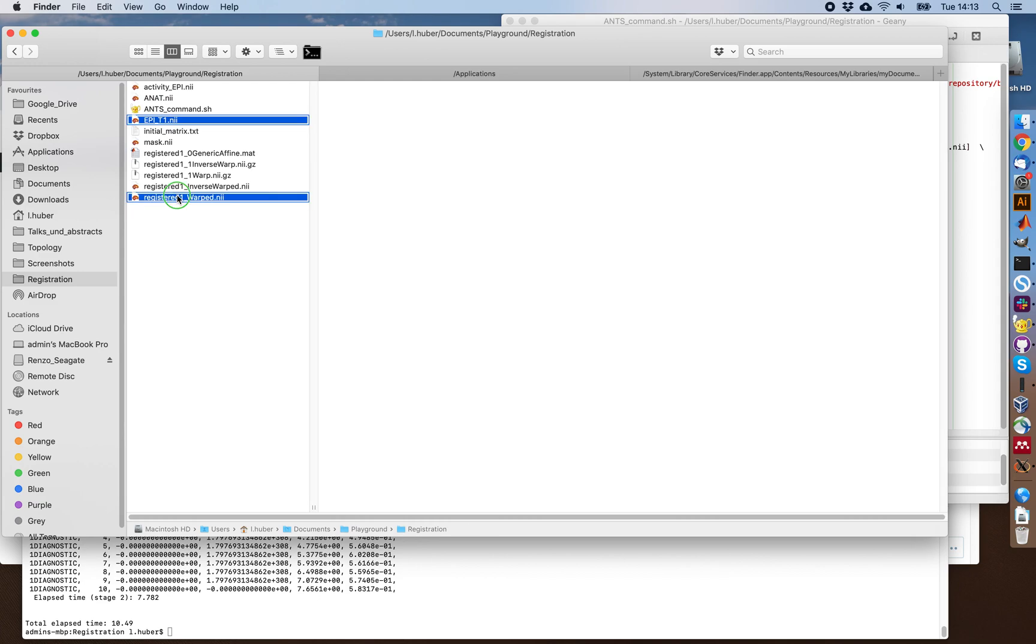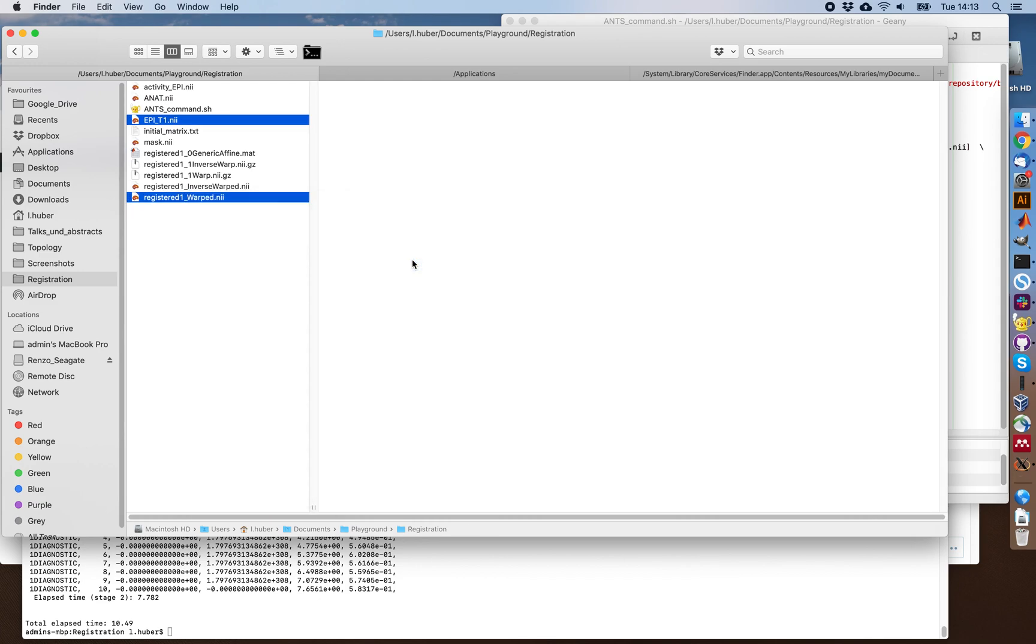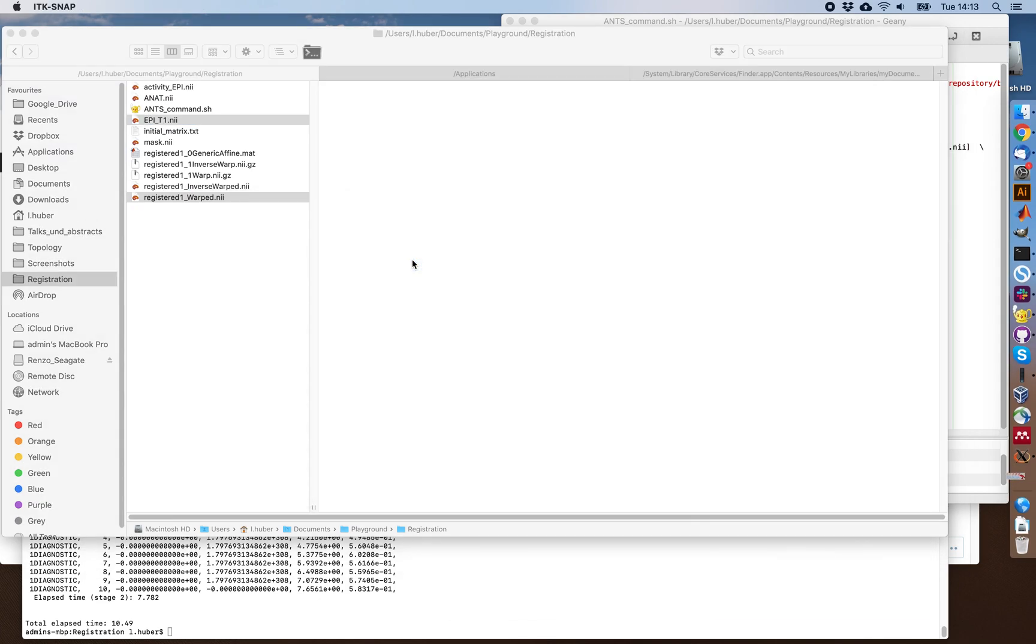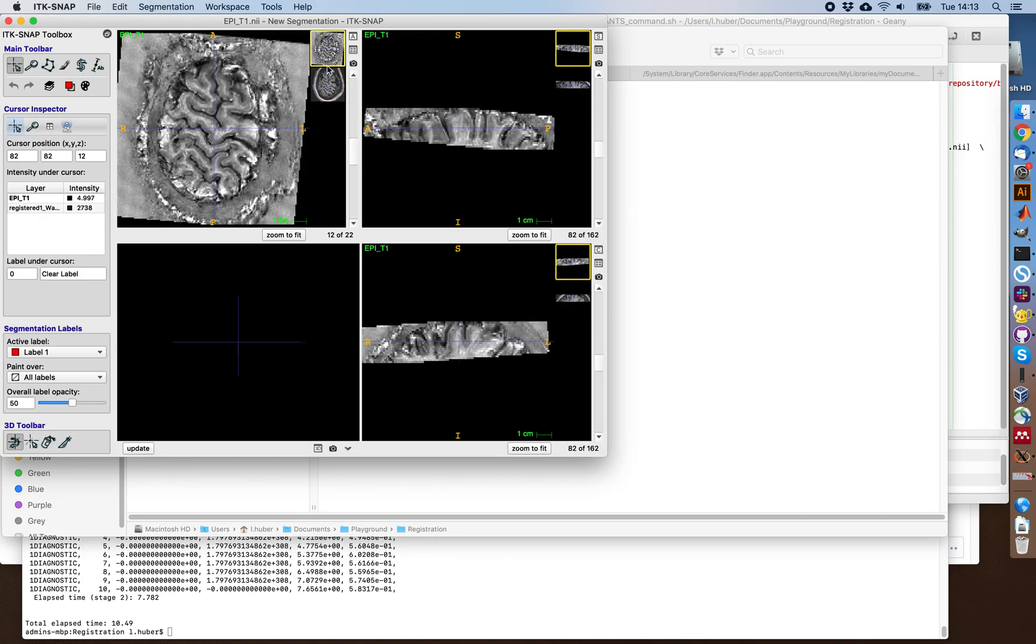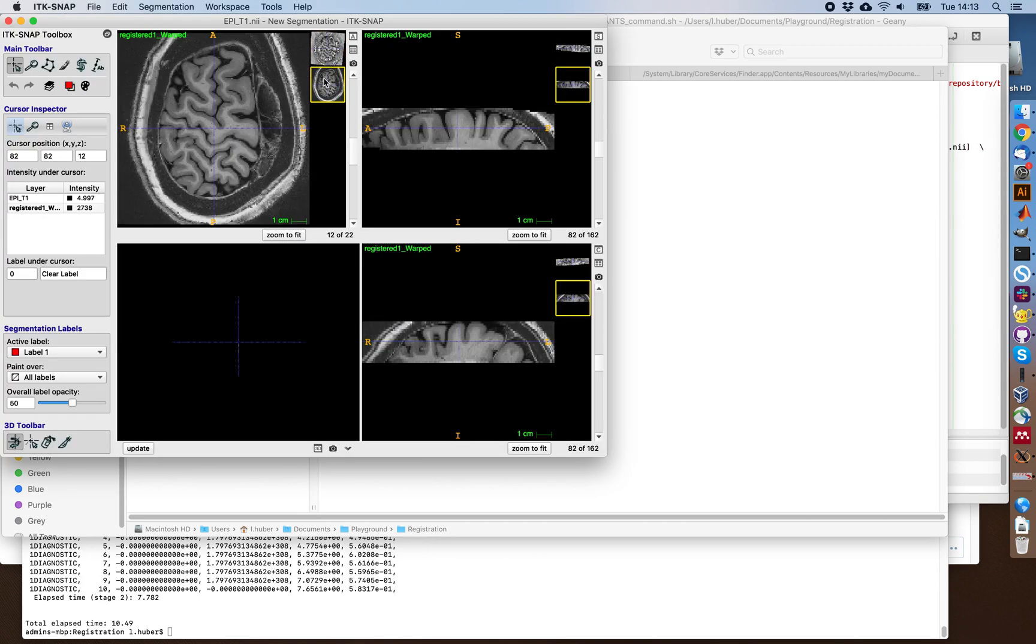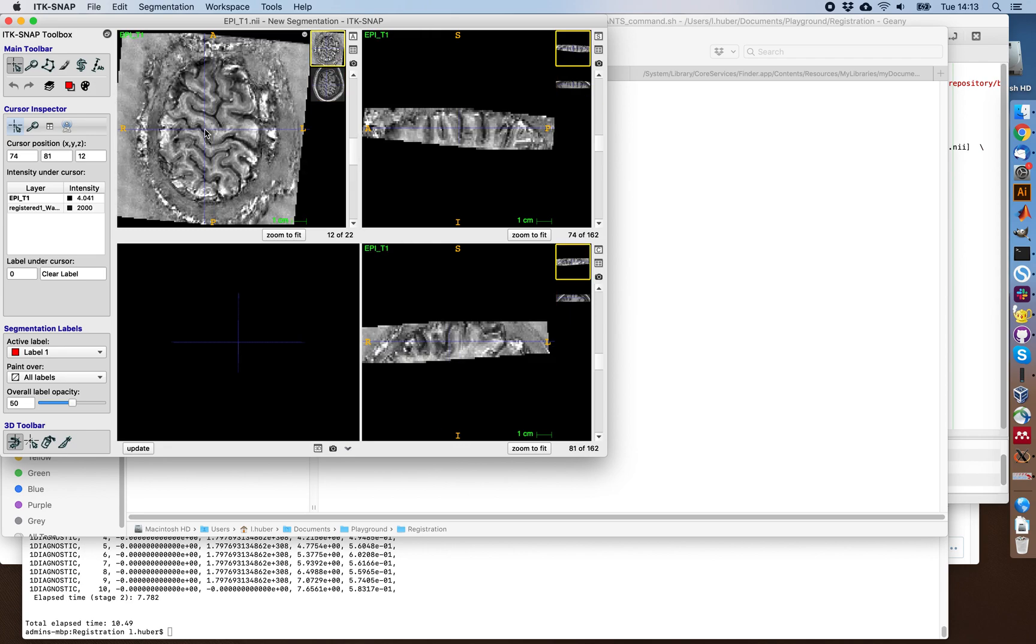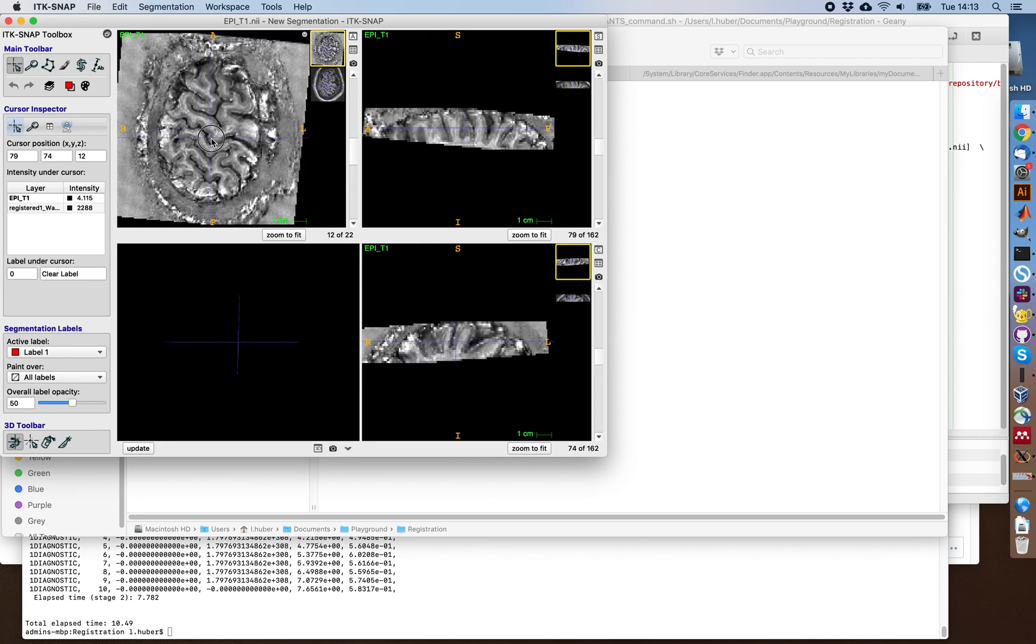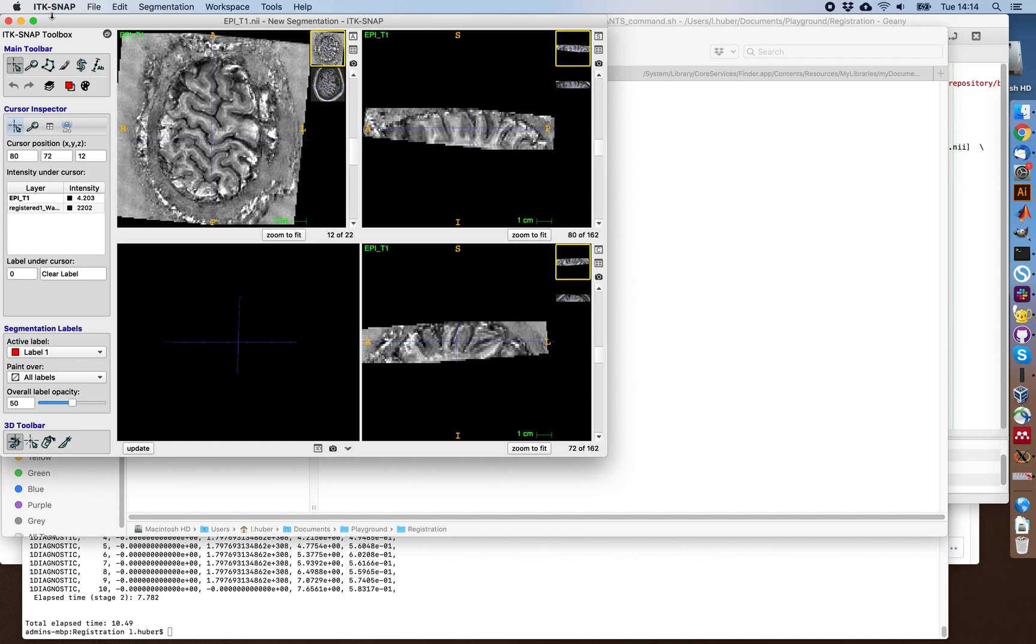For example, we can now look at that with ITK-SNAP again and see. And here flipping back and forth, you can see that we have quite large errors outside our region of interest where we did not optimize the registration tool. However, in the central sulcus right here, the two different contrasts align pretty well.